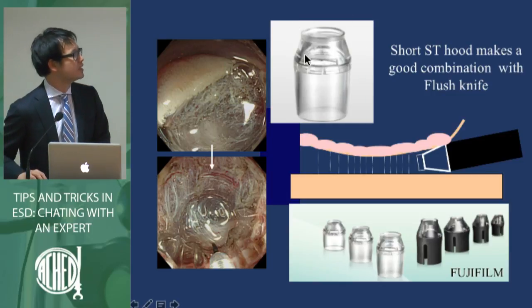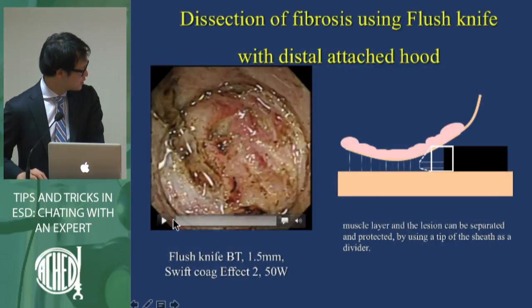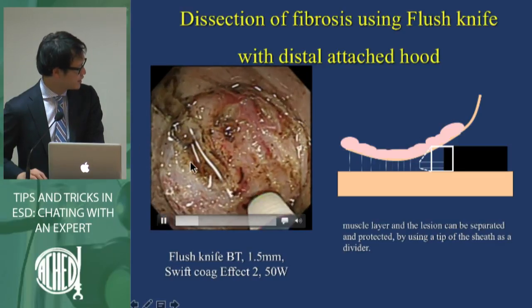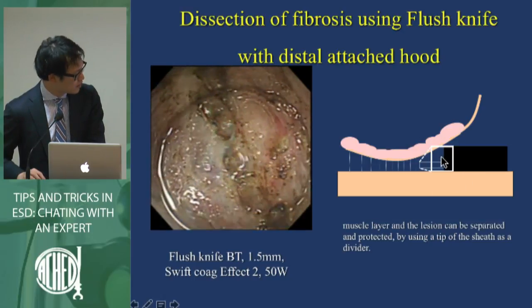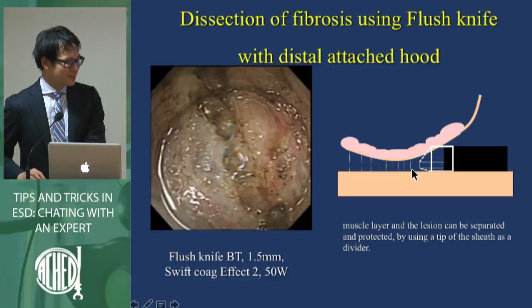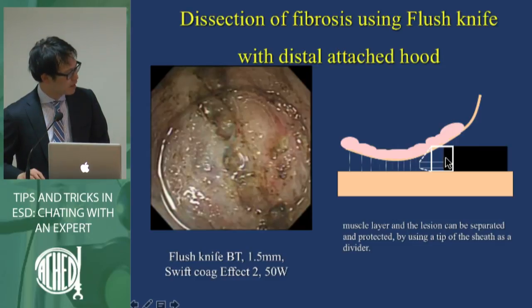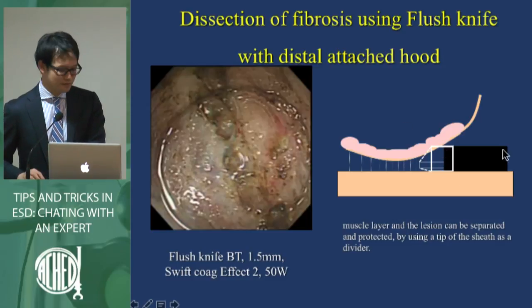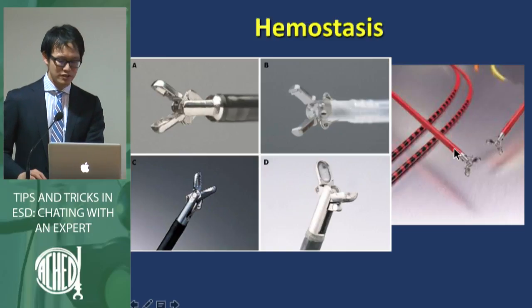This short ST hood makes a good combination with the flush knife. If it has fibrotic areas, you can see that this attachment can elevate the lesion. This attachment is very important because we are using only one scope, and it keeps good visualization. And hemostatic forceps are also good equipment.